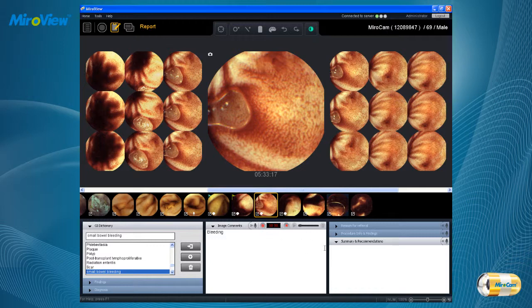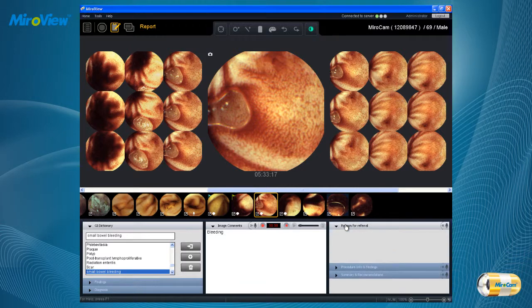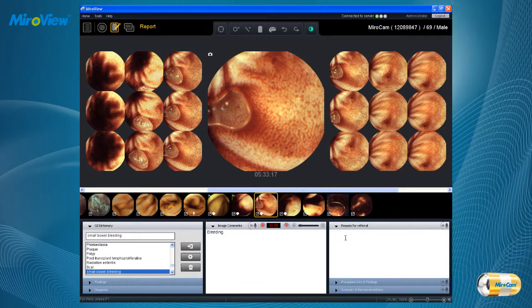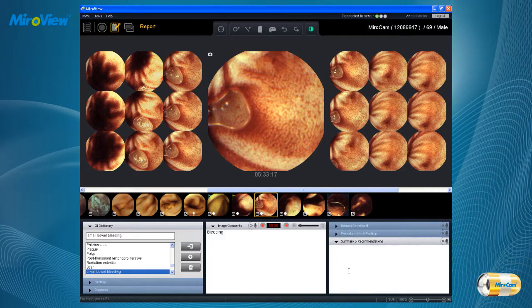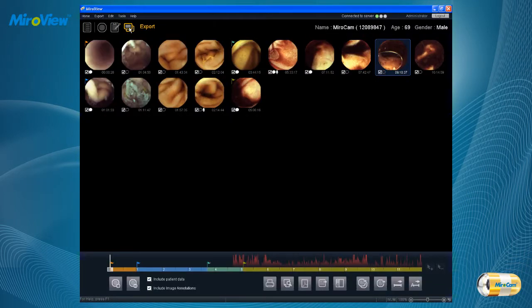Complete the remaining tabs: reason for referral, procedure info and findings, and summary and recommendations. After completing the report, enter the export mode to print the report, create a file, and export the review.